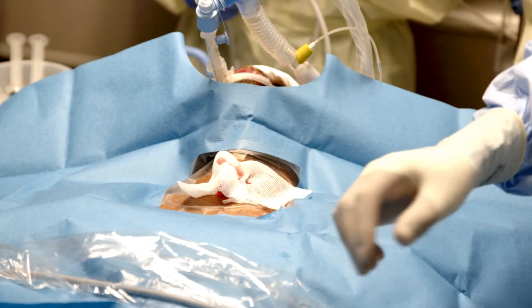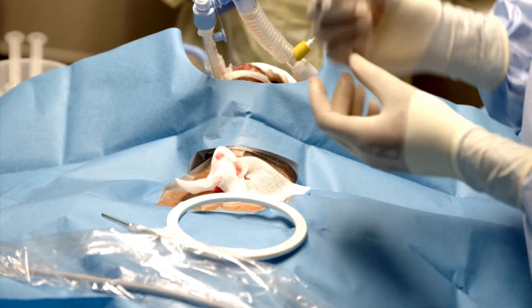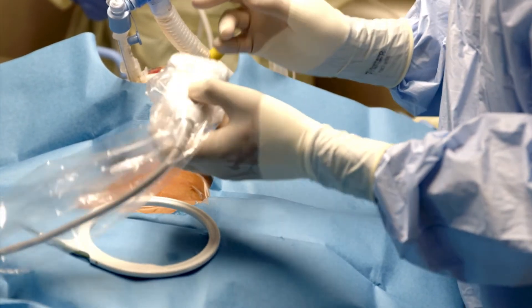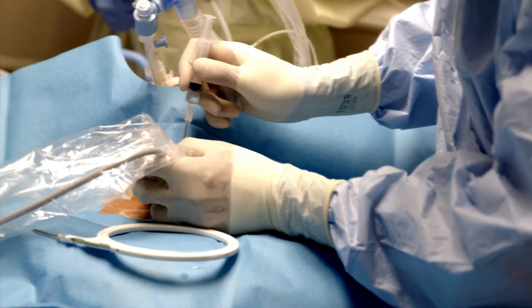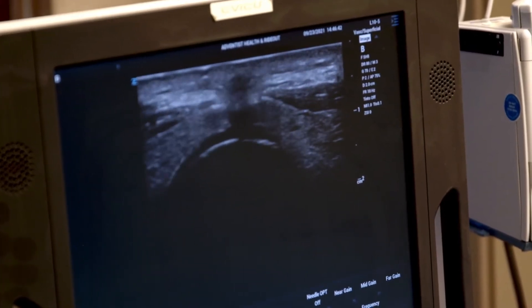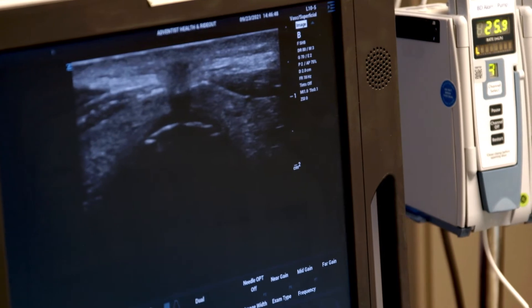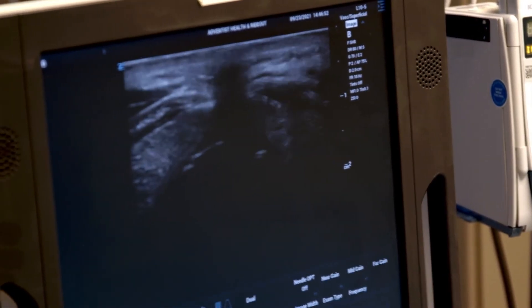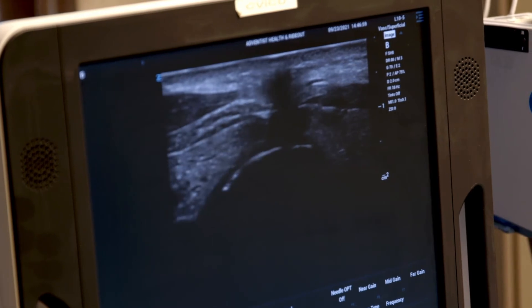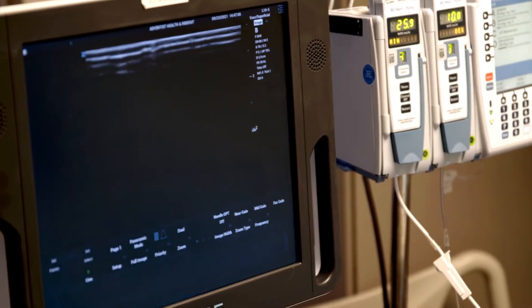Make sure the sats are good — we're at 100%. Get the wire ready and the large-bore needle with some saline. This part is just like doing an ultrasound-guided central line. Look with the ultrasound probe — you're going to see the tracheal rings and your needle coming in. Put the balloon down on the endotracheal tube. I'm going to make sure I'm right in the center, push in and aspirate — I have air back. Now I'm going to put my wire in.